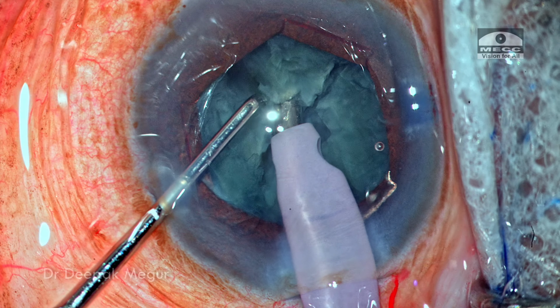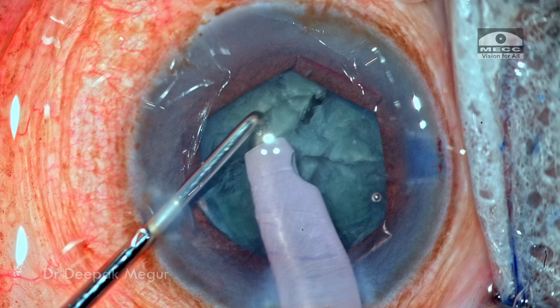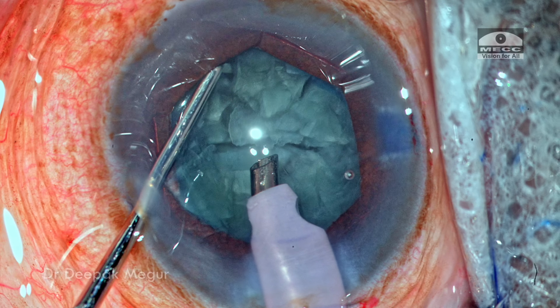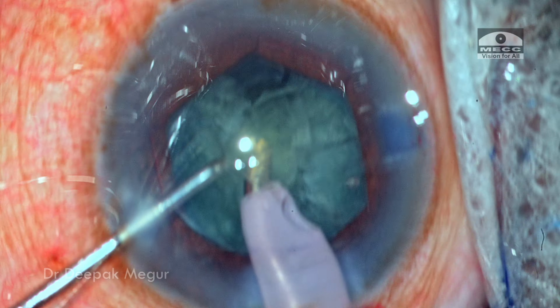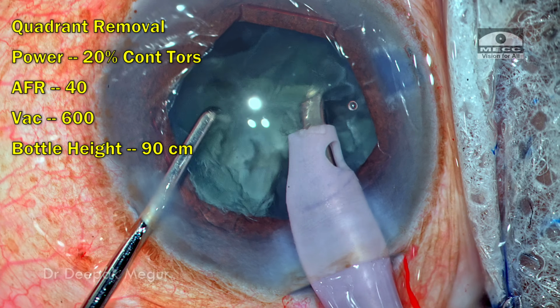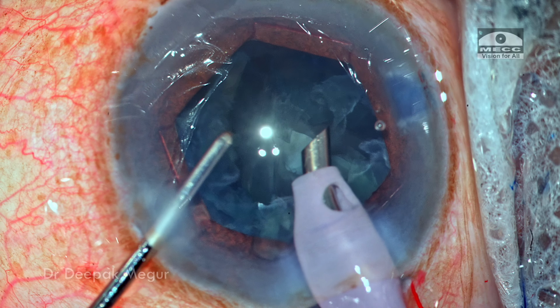The nucleus is very soft. It's not a big issue to deal with this nucleus. The only critical factor is to use the right amount of phaco energy. So lower the better, and using a longitudinal energy ensures that we get at least some grip to hold and then do the vertical chopping. Now is the time to emulsify each of these fragments, and it's done quite easily and quickly.